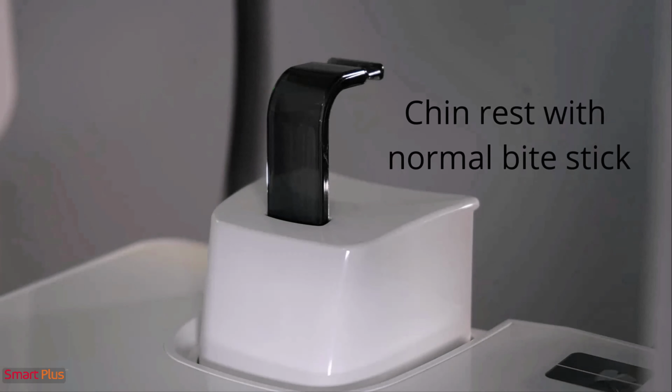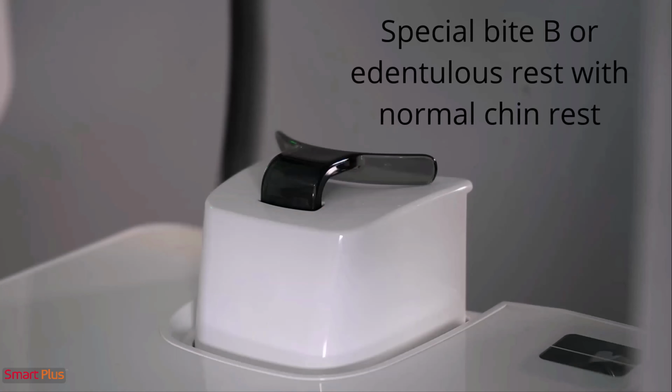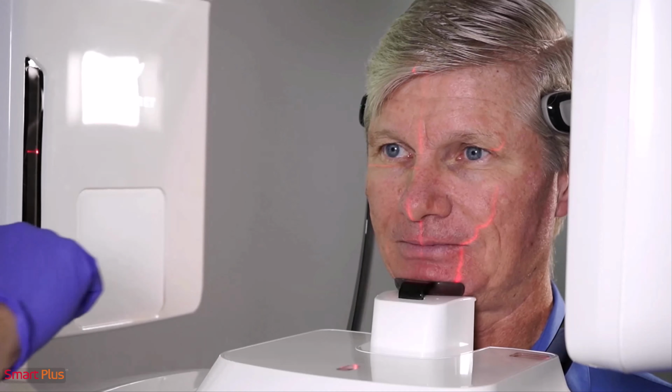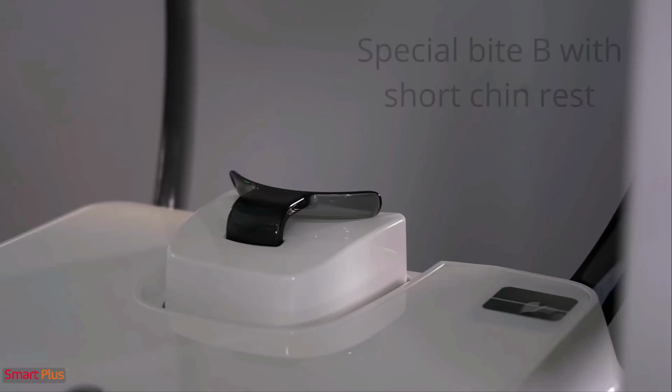Chin rest with normal bite stick. Special bite B or edentulous rest with normal chin rest. Additionally, use a cotton roll to separate the bites. Special bite B with short chin rest. Utilize the short chin rest with special bite B edentulous rest.